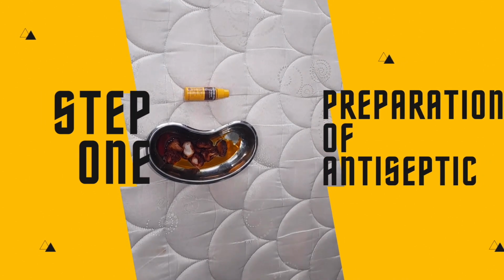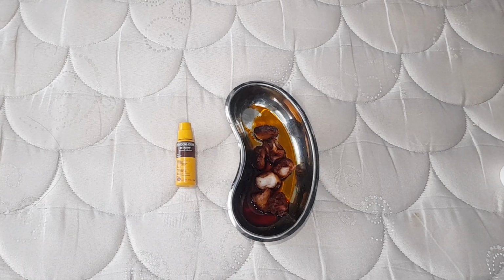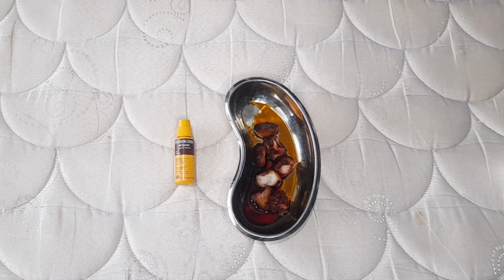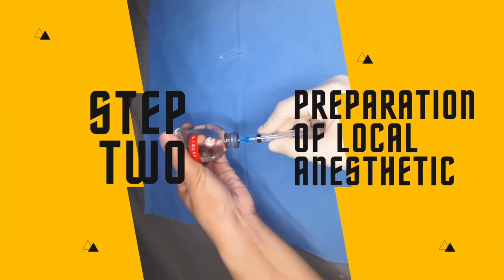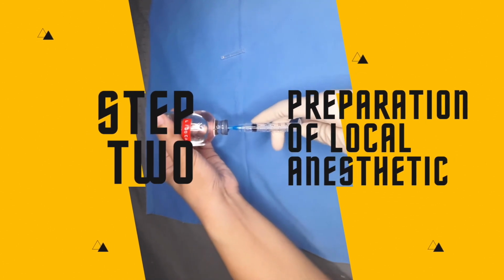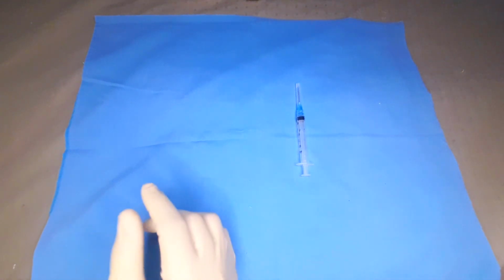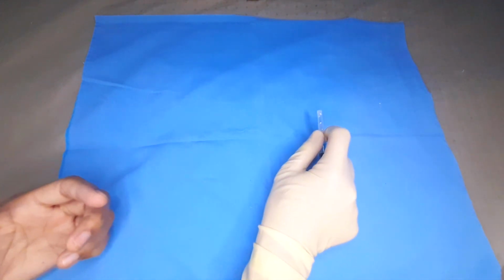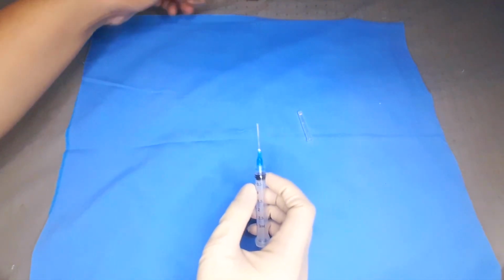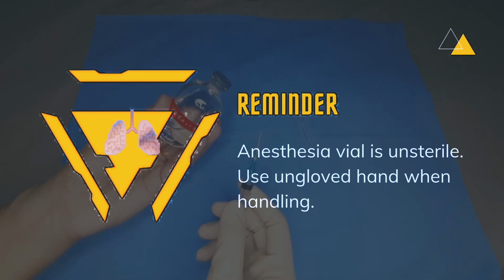Step 1. Preparation of antiseptic. Soak the cotton balls in povidone iodine. Make sure to follow sterility protocols all throughout the procedure. Step 2. Preparation of local anesthetic. Reminder: anesthesia bottle is unsterile.